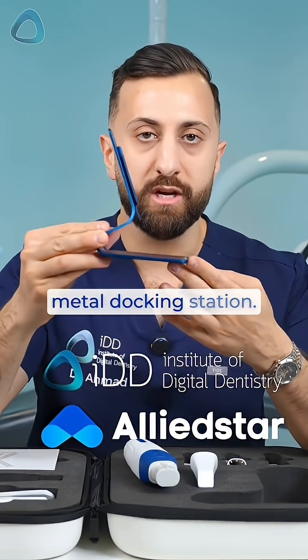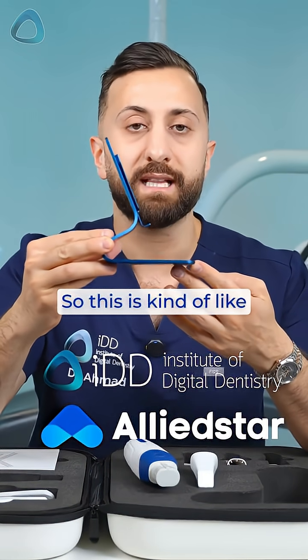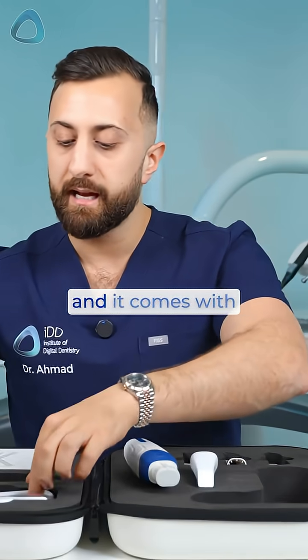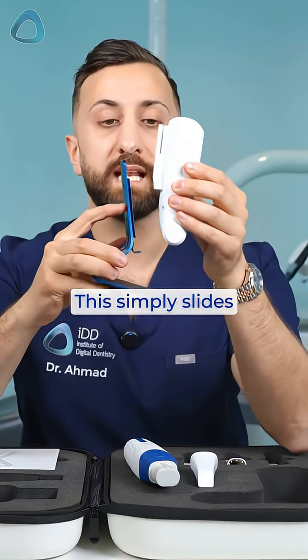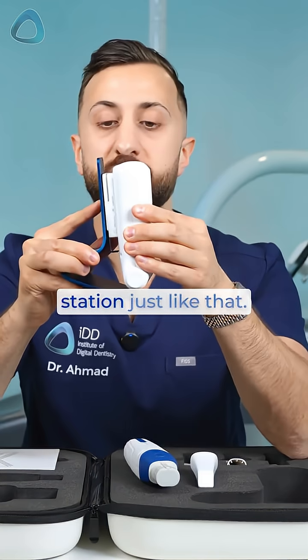We have this little metal docking station, which is kind of like the scanner holder. It comes with this component here — this simply slides onto the metal station just like that.